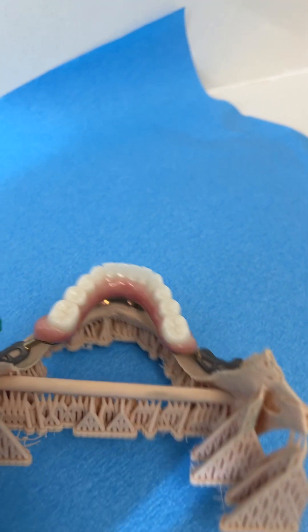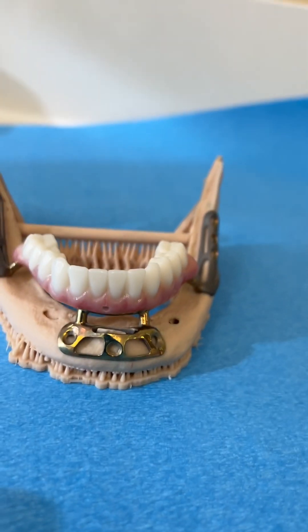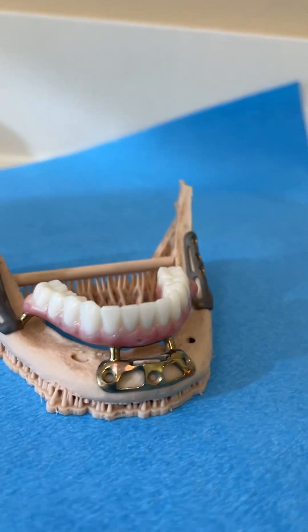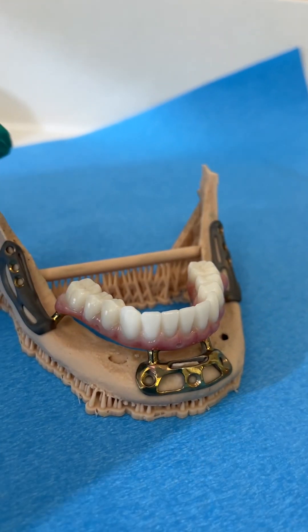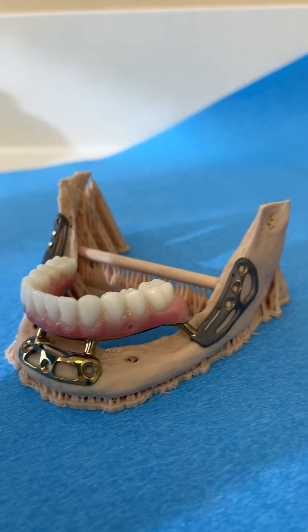This is not removable by the patient. This is a custom subperiosteal dental implant — they're one-of-a-kind, made for the patient, typically done on the lower jaw and typically not recommended on the upper jaw. This is Dr. Ramzi Amin in Burbank, California. I'll post this, so if there are any questions, please let me know. Thanks so much. Bye.